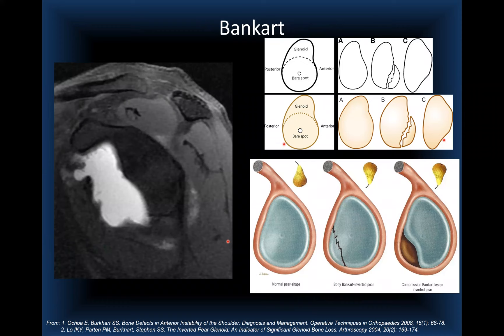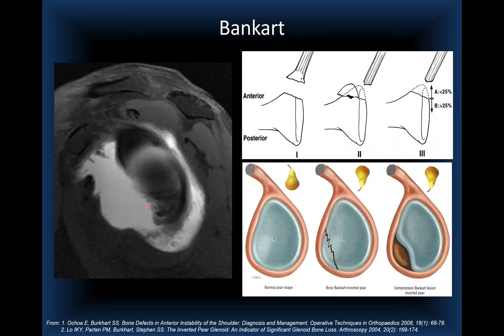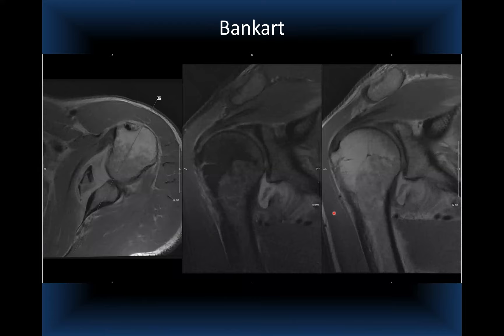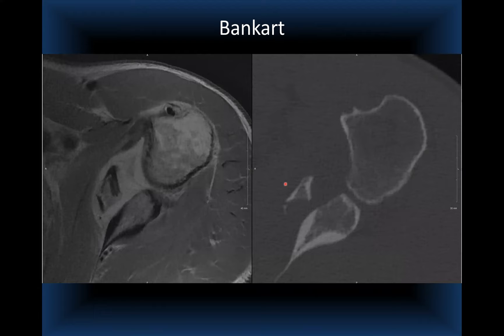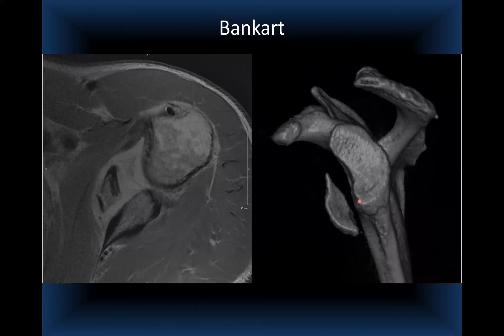The inverted pear morphology was proposed by Dr. Stephen Burkhart. A case with a sizable bony Bankart on axial and coronal images shows the extent of soft tissue injury and multiple fragments avulsed from the anteroinferior glenoid rim. CT correlation shows mild comminution and the 3D reconstruction demonstrates the anteroinferior displacement of the Bankart fracture fragment.